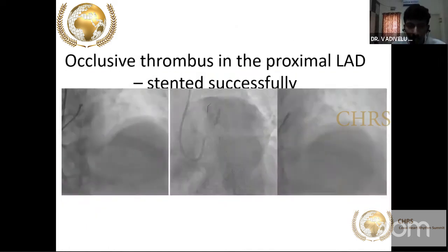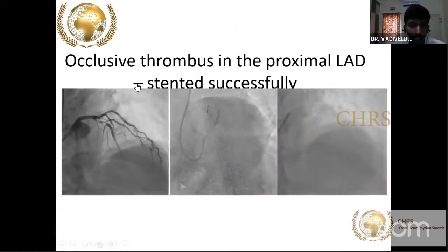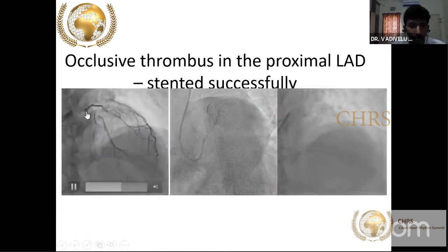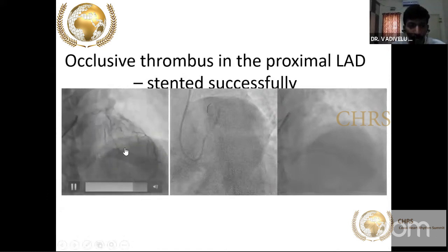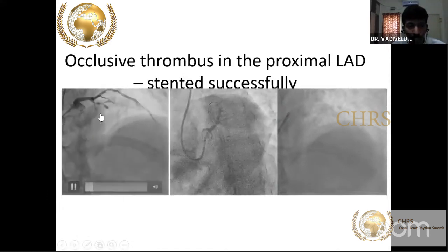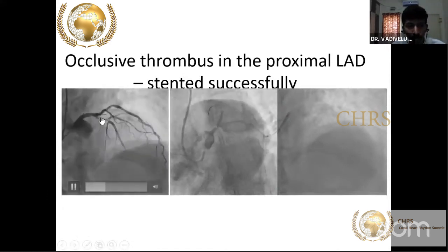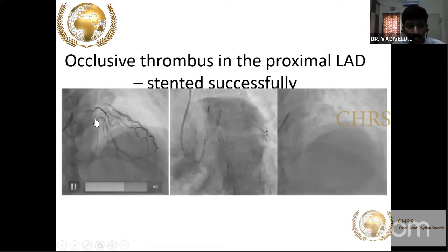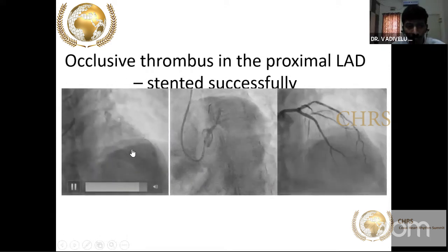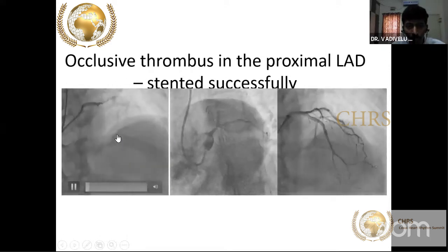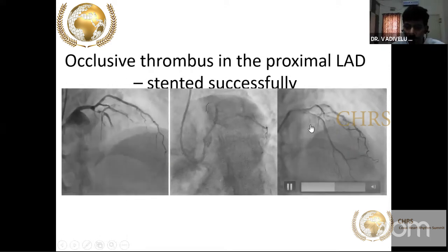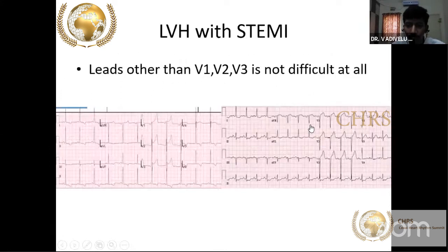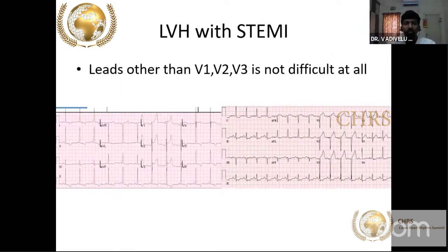The patient, if you send them home, will go and have an anterior wall MI. This patient had 99% stenosis with TIMI flow present, and this is after successful angioplasty. It is very, very difficult sometimes.